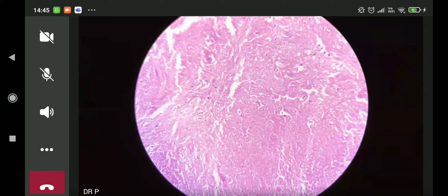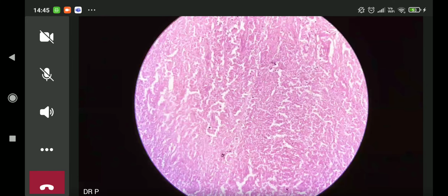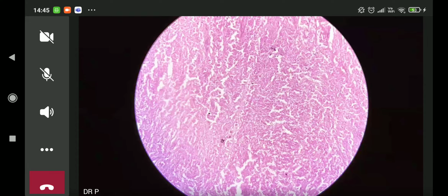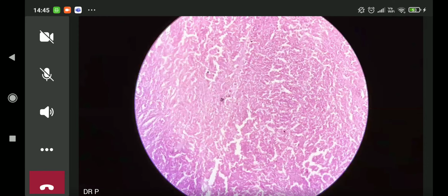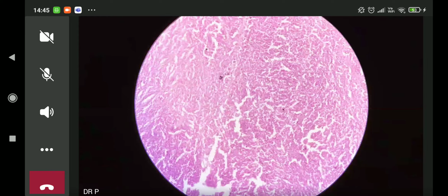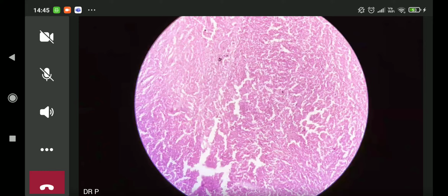It's not homogeneous, and it has some nuclear debris also. So this is reflective of necrosis. Had it been apoptosis, apoptosis has something called apoptotic bodies. In the apoptotic bodies, you would have well-defined rounded structures. Over here, everything is lost. Now that is primarily a feature of necrosis.